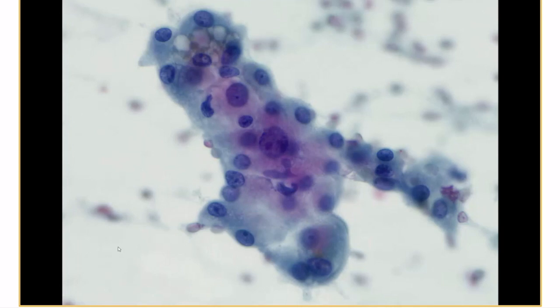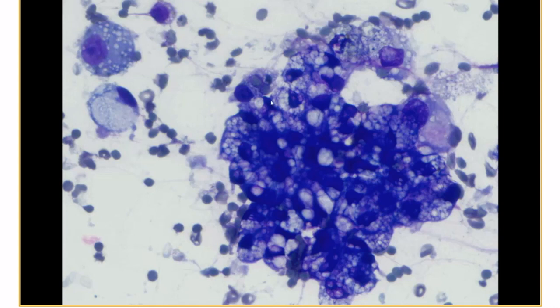This was not a very cellular sample, but there were groups of cells with some degree of nuclear differences in sizes and shapes, so some pleomorphism, abundant oncocytic and somewhat vacuolated cytoplasm. On the Diff-Quik stain, you see very coarsely vacuolated cytoplasm with secretions.